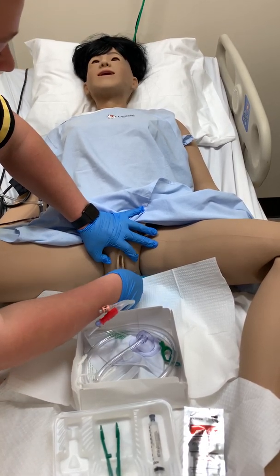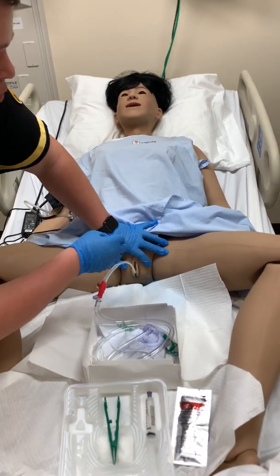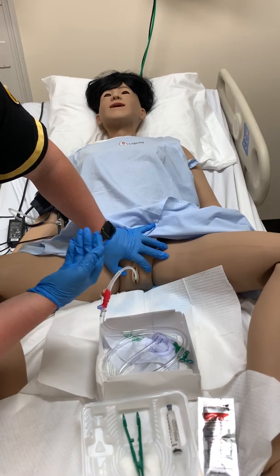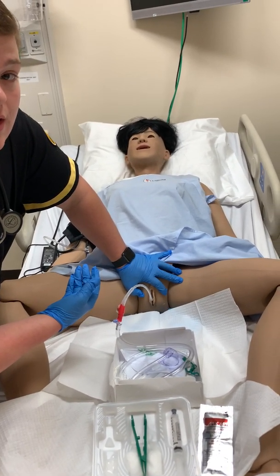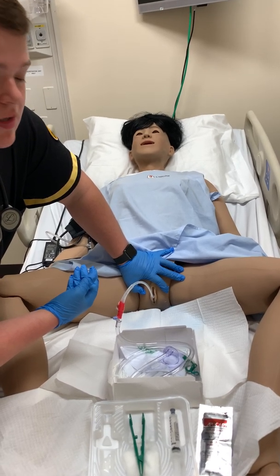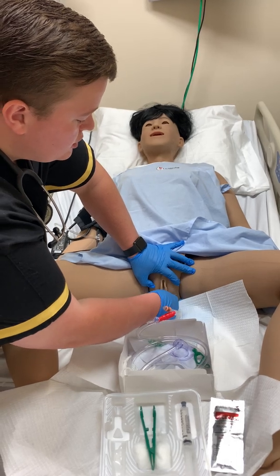And after that point, say right now, we just saw urine start to come down. We're going to insert another 1 to 2 inches to make sure the catheter is completely inside the bladder, because we don't want to inflate the balloon inside the urethra. That's going to cause great discomfort for the patient. It's just going to be bad. So we'll insert another 1 to 2 inches.